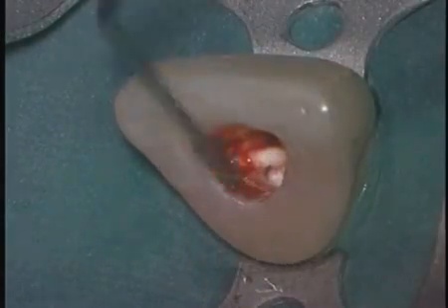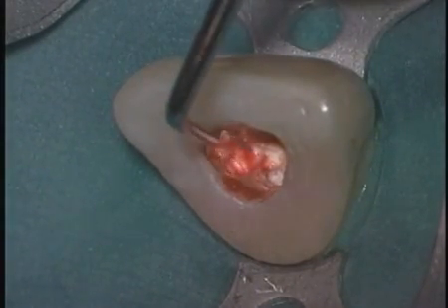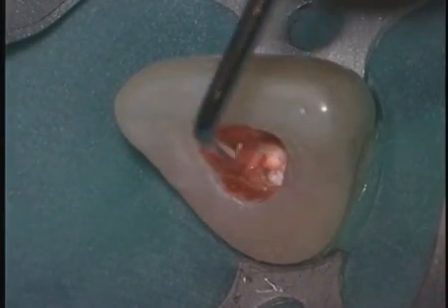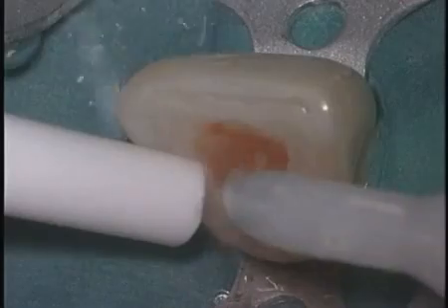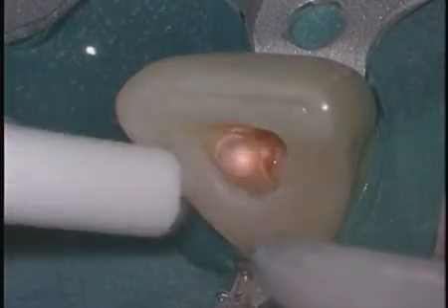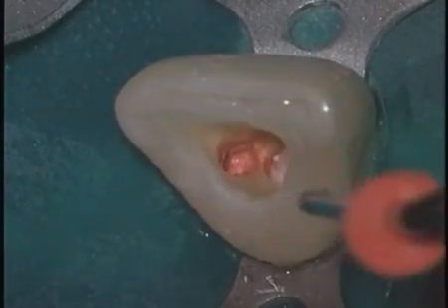We carry it in with a spinal tap needle and inject small controlled aliquots into the defect. West Perf Repair instruments trowel the material into the defect and begin to shut down the bleeding. Flushing the field out clarifies our vision, and it allows us to place more calcium sulfate into the defect. This material is condensed purposefully out into the bone.